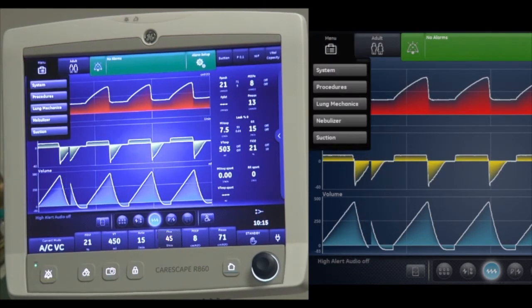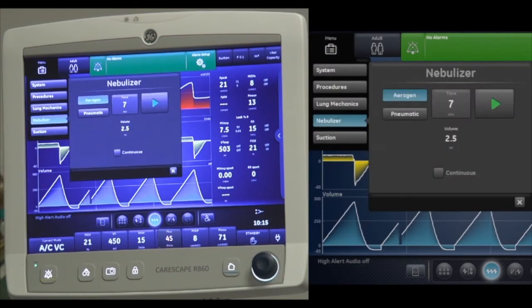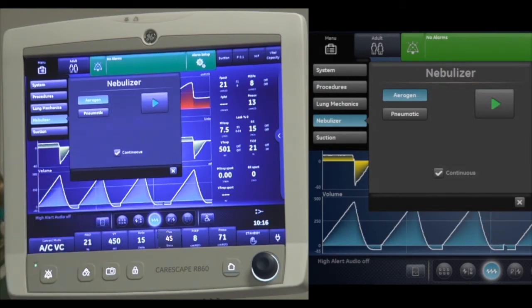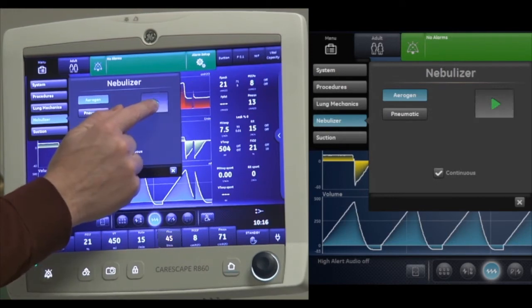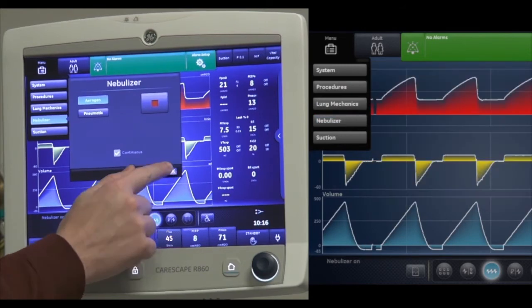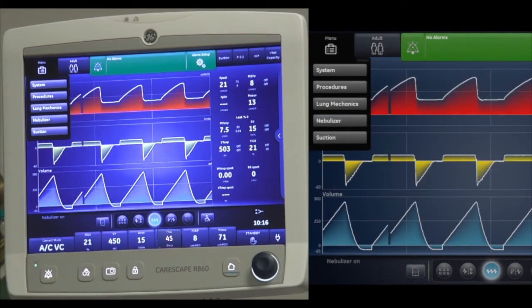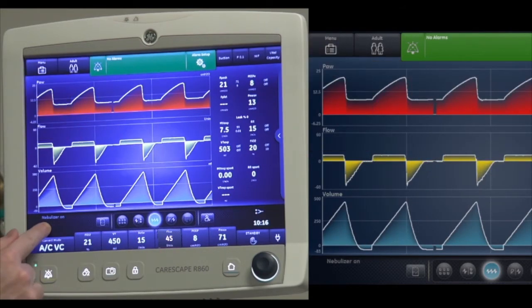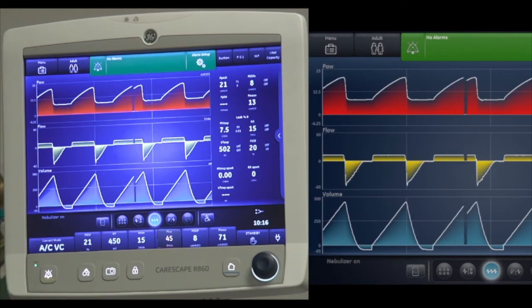Let's go back into nebulizer — you can also use the Aerogen continuously. So instead of a set time, you can check continuous. This is useful when delivering medication via IV or infusion pump. It just gives the message that the nebulizer is on.